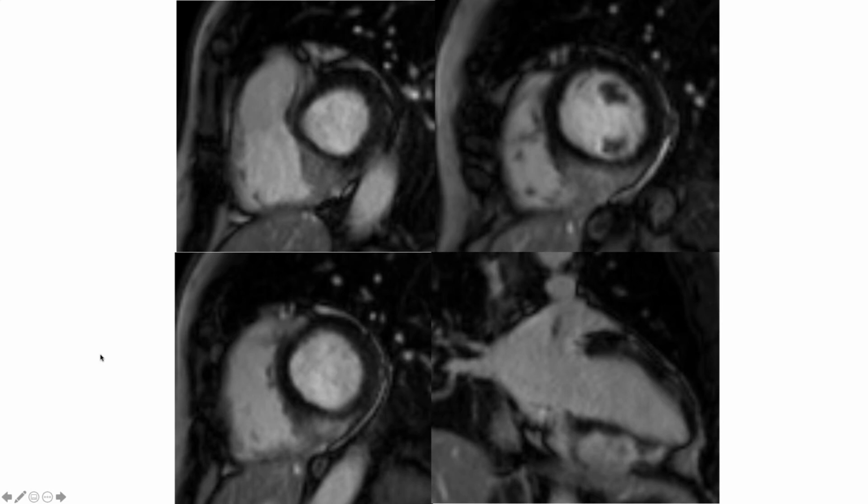This is a little bit post contrast injection, so you can see something enhancing in the distal septum as well on the two-chamber view, again done a few minutes after contrast. I don't know if you do that at your centers where you do the short axis and then you inject and then continue doing the cines. That's what we do at our institution just to save time. So we often see the beginnings of enhancement.